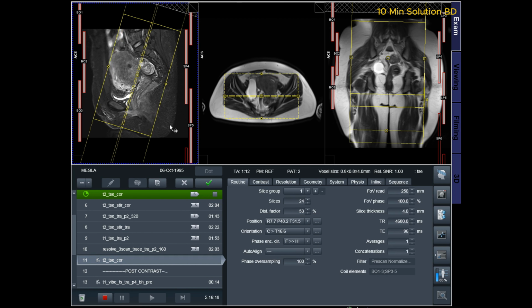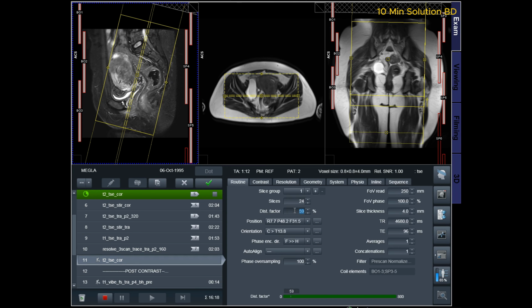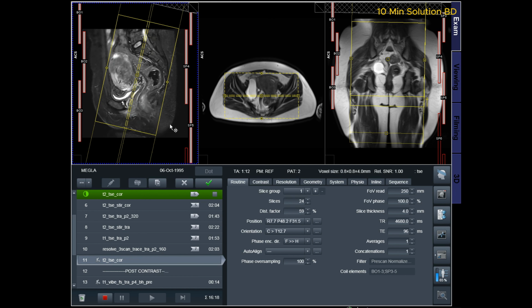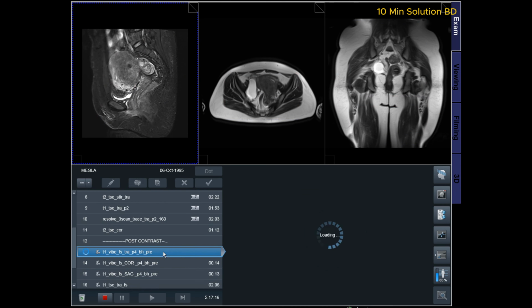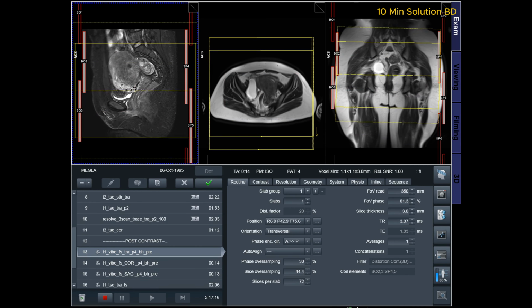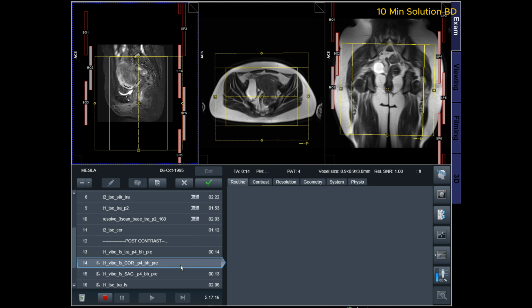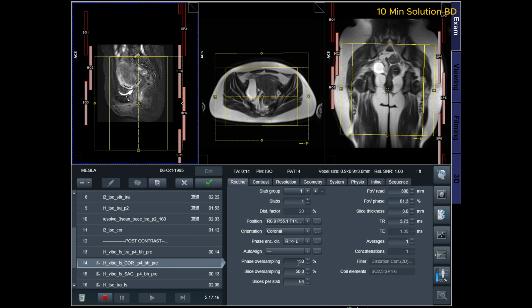Indications for MRI female pelvis endometrial scans. For the evaluation of pelvic floor defects associated with urinary or fecal incontinence. Prior to a myomectomy, hysterectomy, or uterine artery embolization. For the evaluation and staging of fallopian tube malignancies. For the evaluation of a congenital anomaly of female pelvis. For the evaluation and staging of soft tissue origin sarcomas.